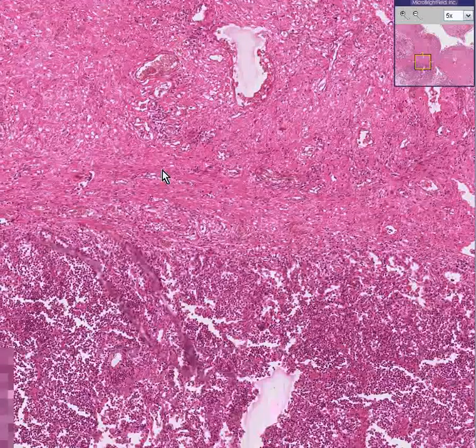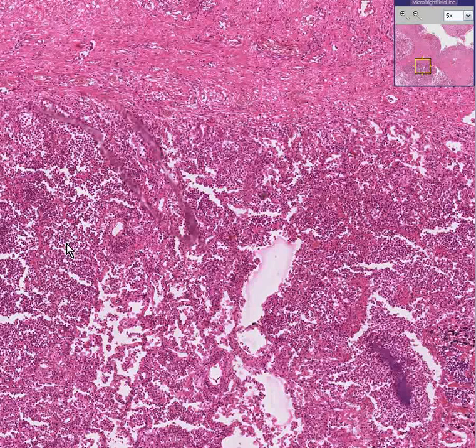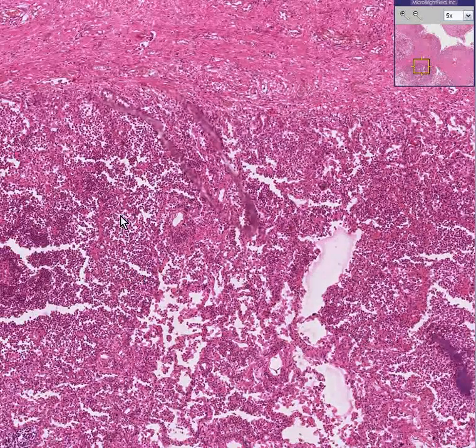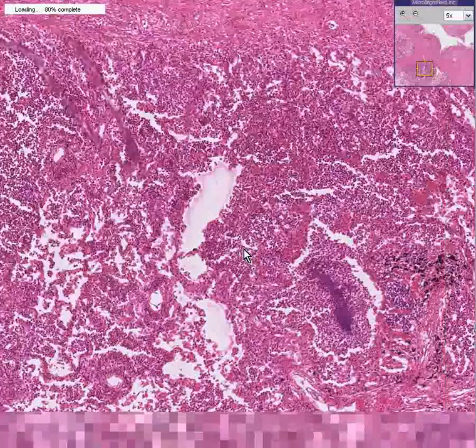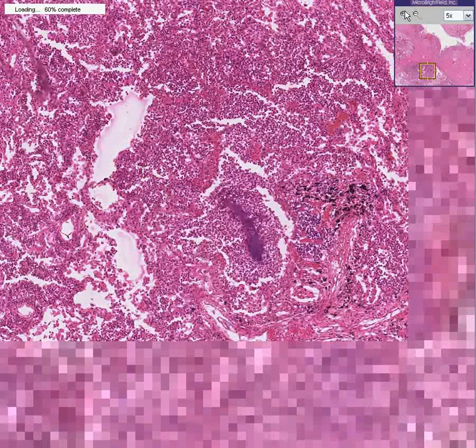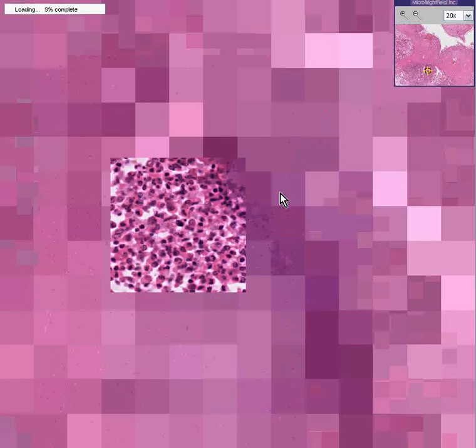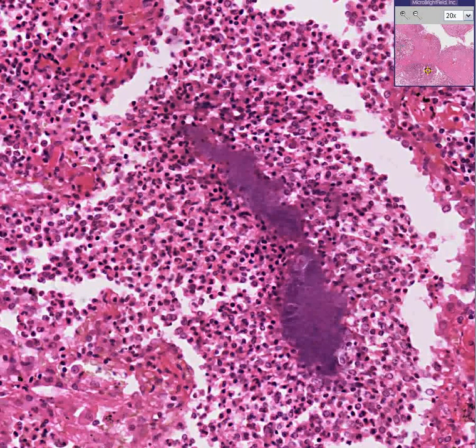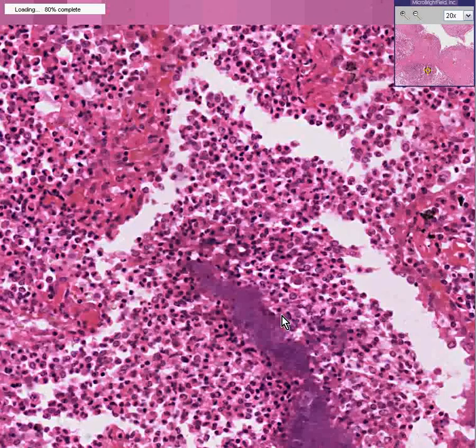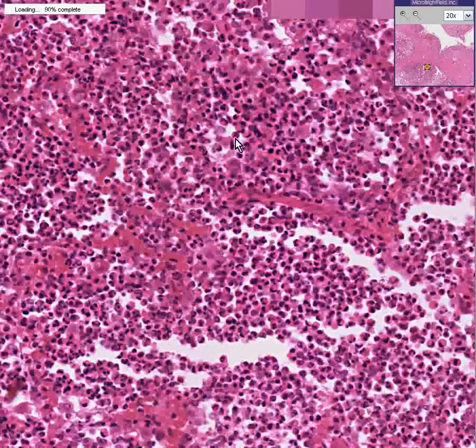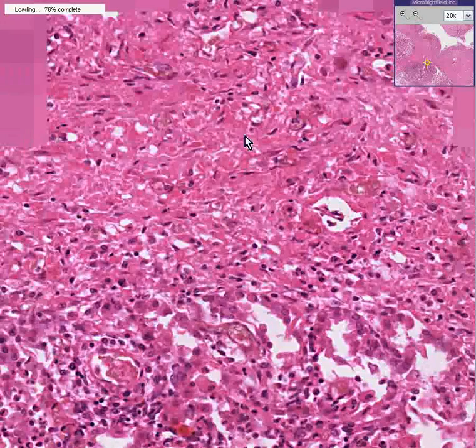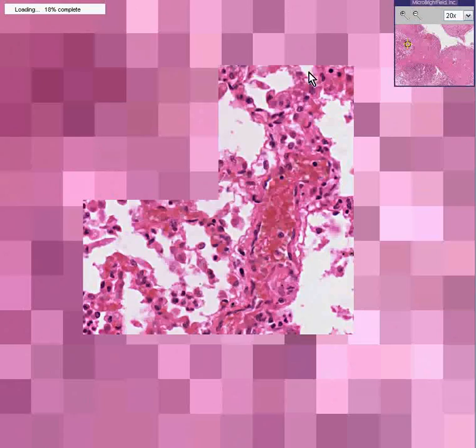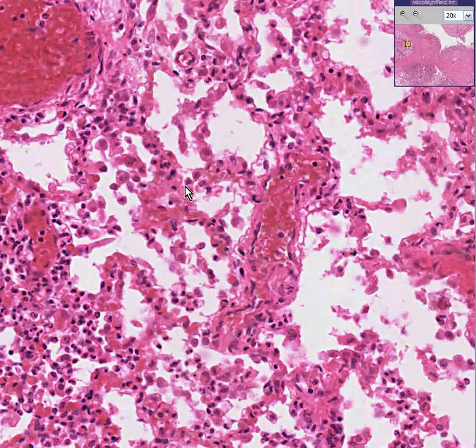Down here you can see some outlines of alveoli still, but for the most part you have this entire area filled up with neutrophils, which by definition is an abscess. So these are all neutrophils and fibrin. This is the abscess. Here is the wall of the abscess, and out here is some remnant, very congested, possibly edematous lung.